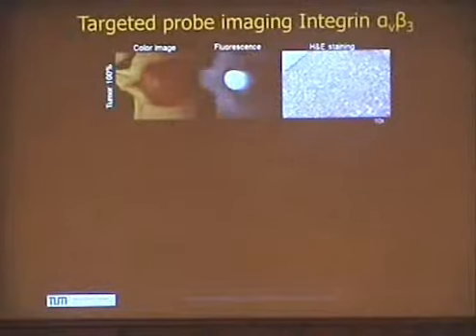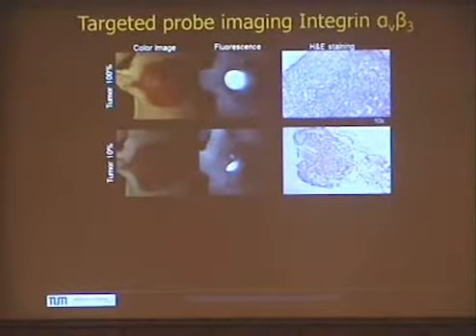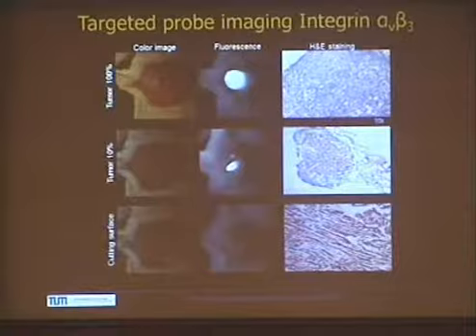Great. Now this is another example. This is another tumor. And we told the surgeon, based on the color image, take 90% out of the tumor. So he did that and he left 10%. But he also left a spot here that was not intentional. It was just a fluorescent spot. He thought that he removed everything here, the spot is here. So we were very interested in this particular spot, and there were some other spots too.